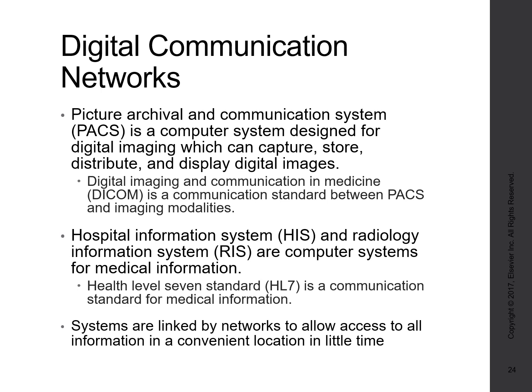And now with PACS, the radiologist can just search that patient. You send the new images across. They're automatically going to be able to pull up all the old images, sometimes from even different facilities. So pretty awesome. A PACS system requires tons of computer storage, but is really life-changing in the medical field. Now, the next one, PACS and DICOM are often confused.